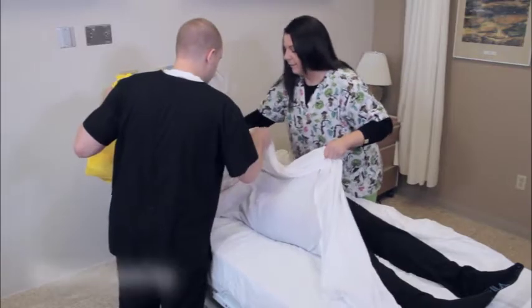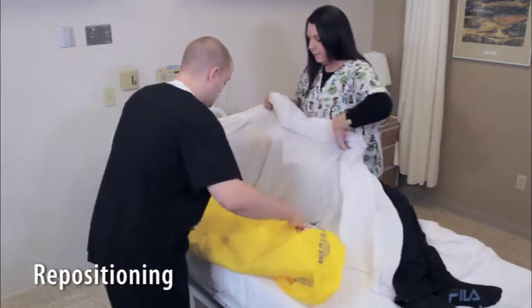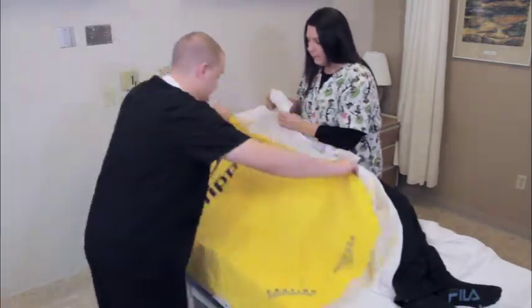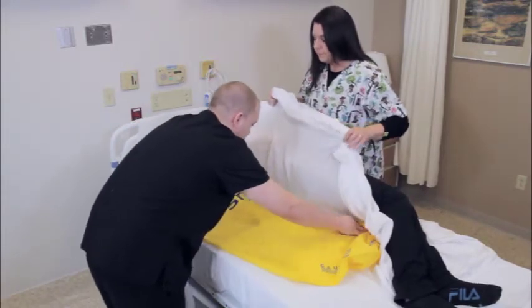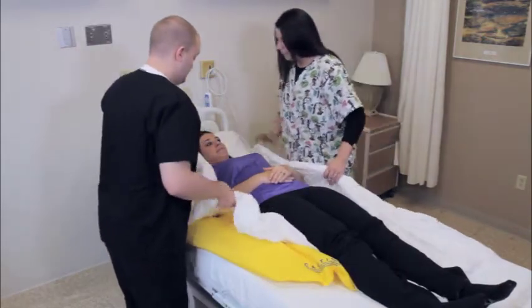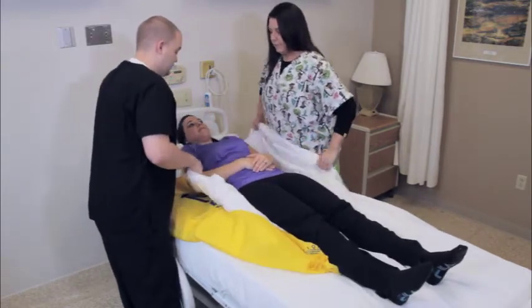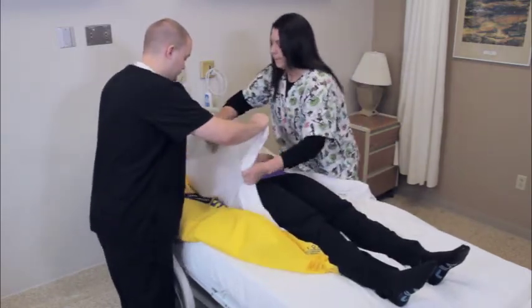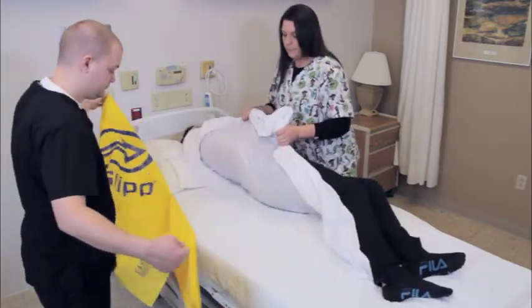To reposition or to boost up in bed using the draw sheet, turn the patient on their side and place the slip under the patient. Make sure the draw sheet is at the top of the slip and that both shoulders and hips are on the slip. Grasp the draw sheet with both hands. Slowly pull the patient up in bed or toward the center of the bed as desired. Then, gently remove the slip.